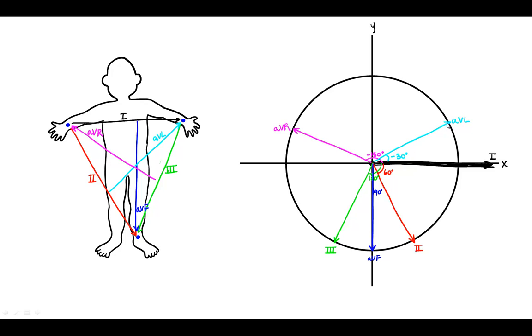And this becomes really important when there are charges moving around inside the heart and you want to determine at what specific angle they're moving across from one side of the heart to the other. So if they're moving, say, at a negative 150-degree angle, that would mean that if this was your heart, charges are moving in this direction.